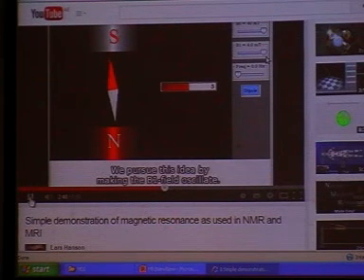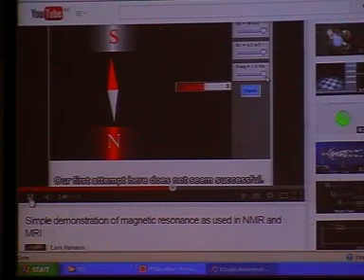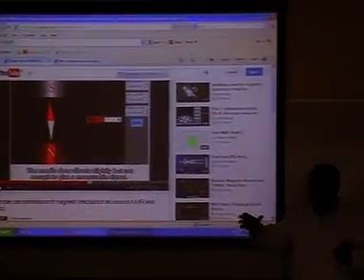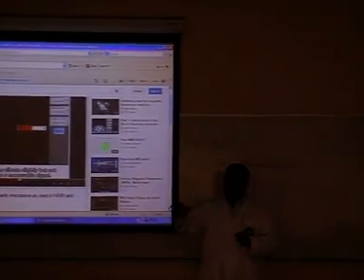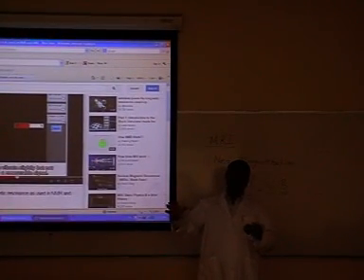We pursue this idea by making the B1 field oscillate. Our first attempt here does not seem successful. The needle does vibrate slightly, but not enough. Now, did you see what he did? He just introduced the frequency. So that means he is adding another type of energy, but at some specific frequency.